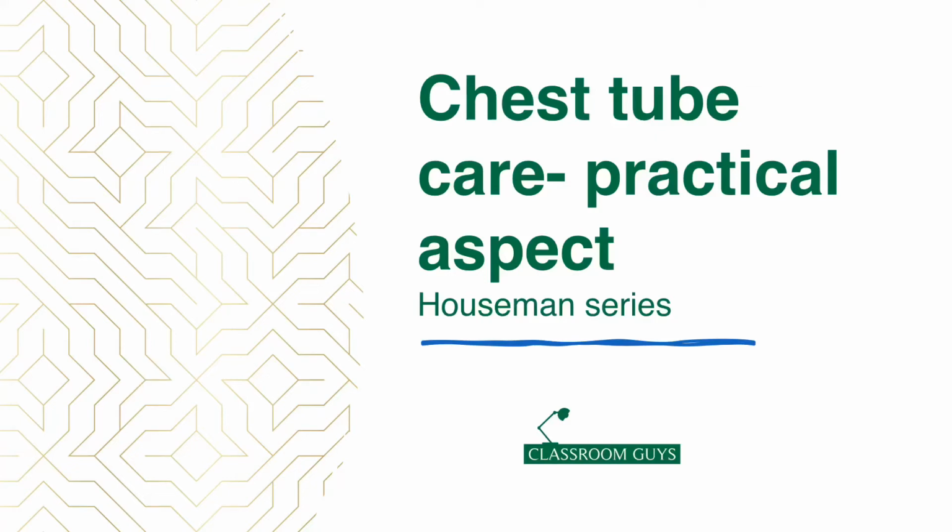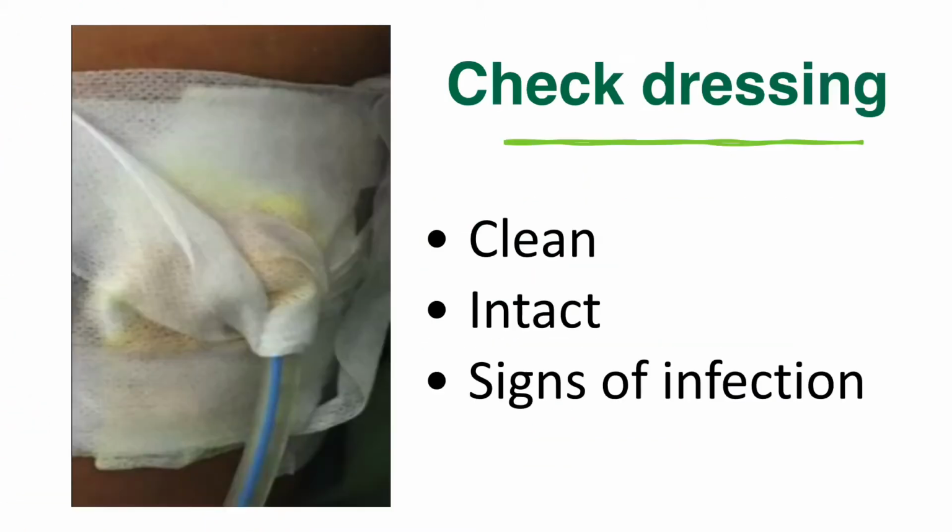Hello everyone, today I'm going to introduce to you the safe and competent management of chest drain. Chest drain is also known as underwater seal drain. Appropriate chest drain management is required to maintain respiratory function and hemodynamic stability. Therefore, assessment of the chest tube and drainage tubing should be done during every review.